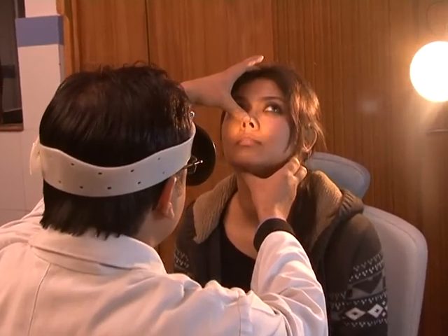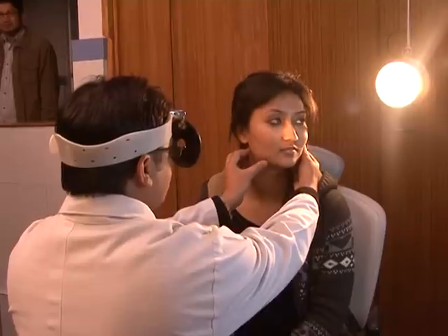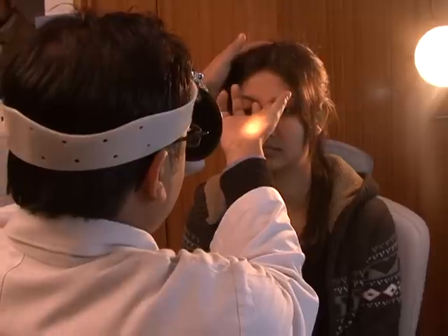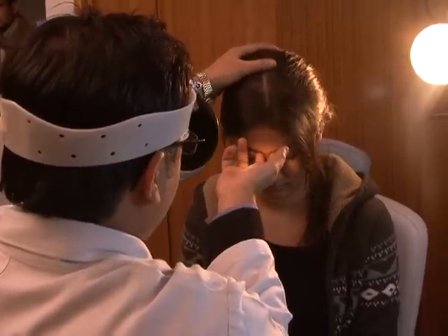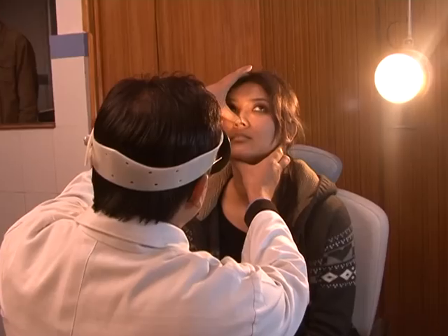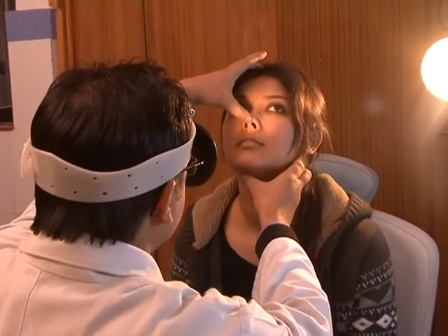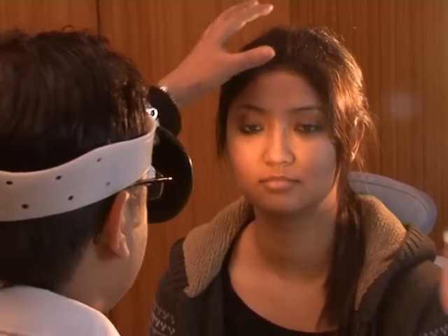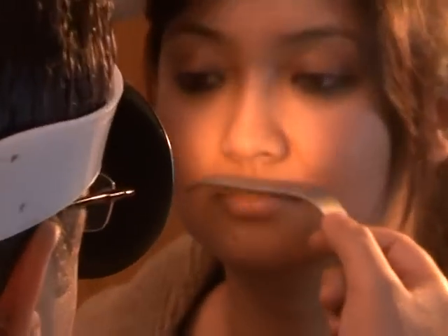Examination of the external nose consists of examination of the anterior and lateral profiles. It starts with palpation of the nose to assess tenderness, crepitus, and deformities. The vestibule is examined by lifting the tip of the nose. The patency test is done by placing a metallic tongue depressor on the vermilion border of the upper lip.